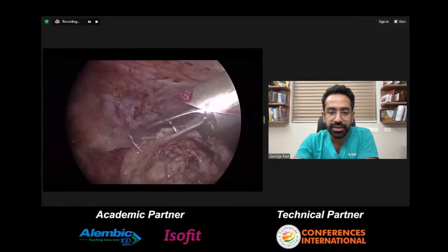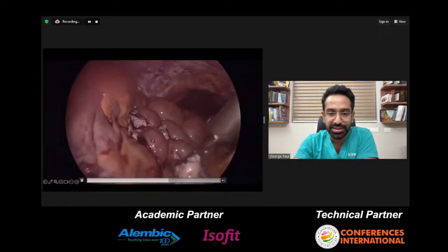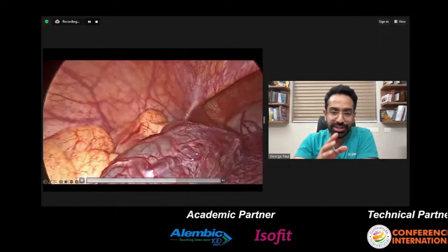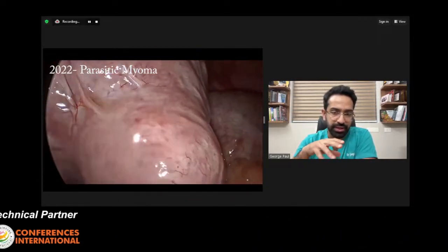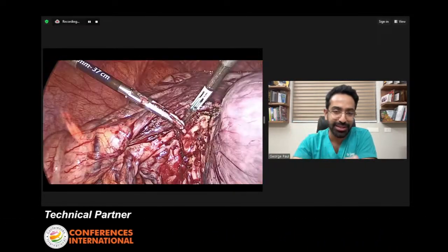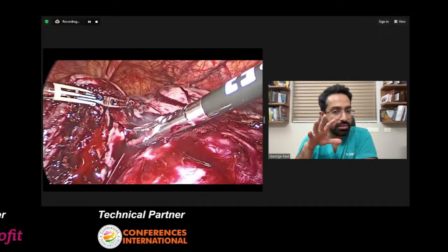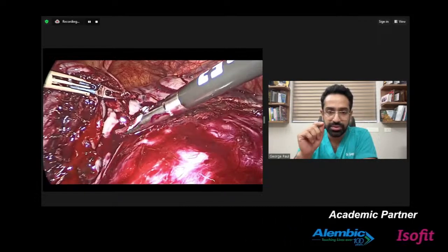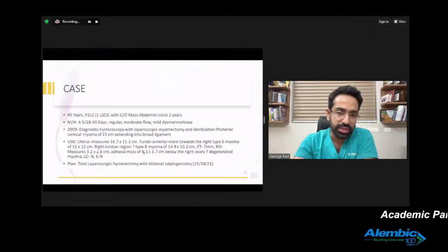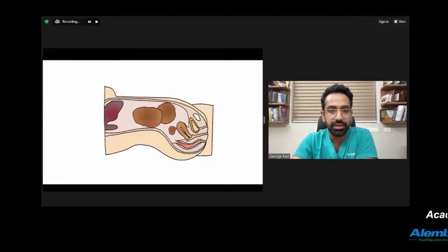So this was the 2015 surgery where we had done uncontained morcellation. You can see the various pieces scattered all over the abdominal cavity. And this is 2022 with a huge mass. In fact, that is the mass that you're seeing, and you can see the uterus, which is completely normal, very innocent looking in the pelvis, and that is the vascular pedicle giving the vascularity towards the parasitic myoma. So initially, I was a bit too adventurous, and it started bleeding. In these situations, using an instrument like LigaSure or properly using your bipolar really makes a difference.